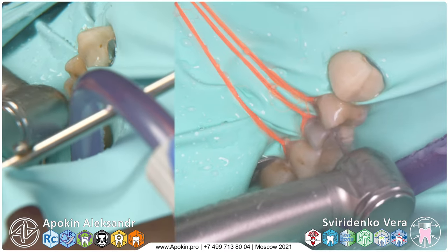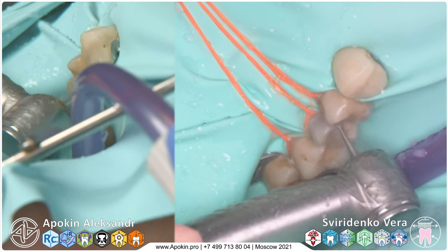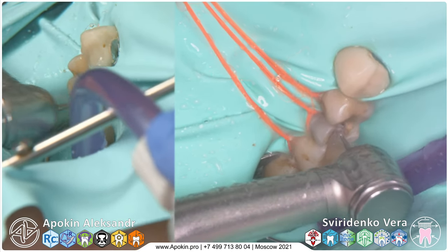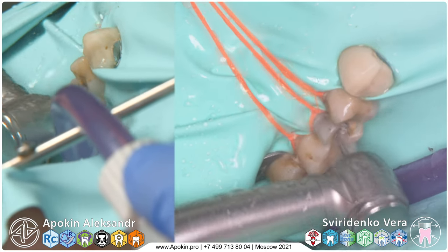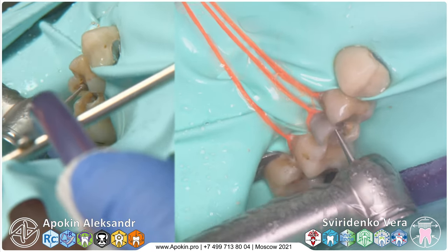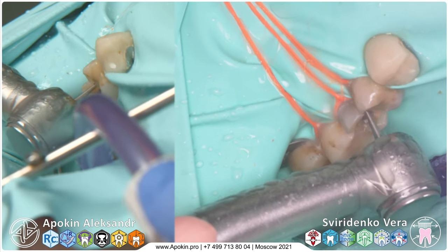We're removing all composites from all parts of the tooth, and in some teeth, for example 15, we plan to make a build up using matrices, rings, wedges and new composites for this part of work. Removing the next composite part.